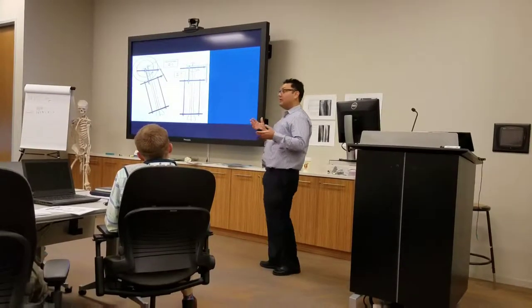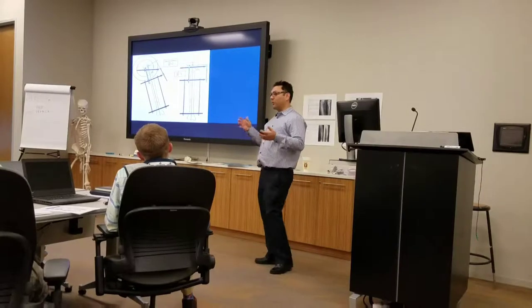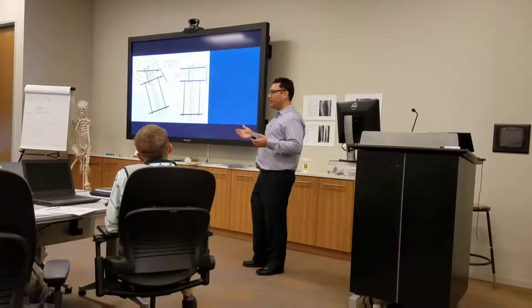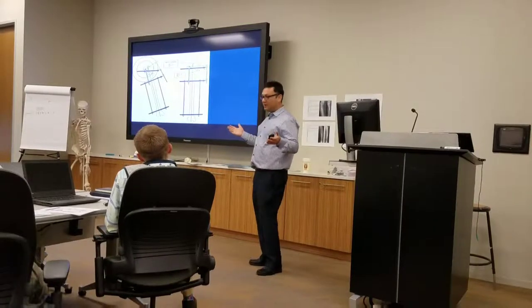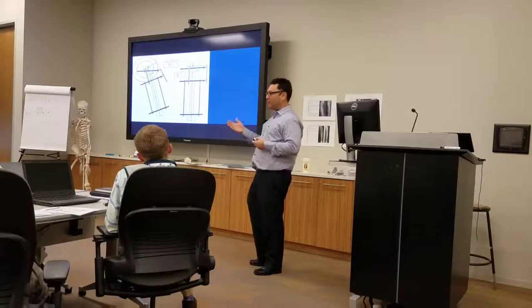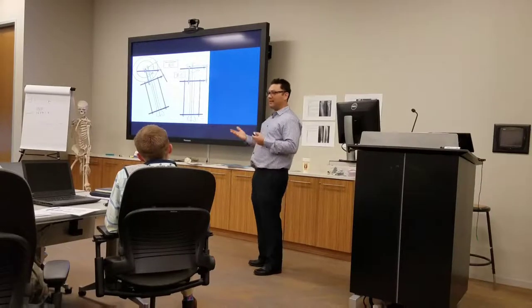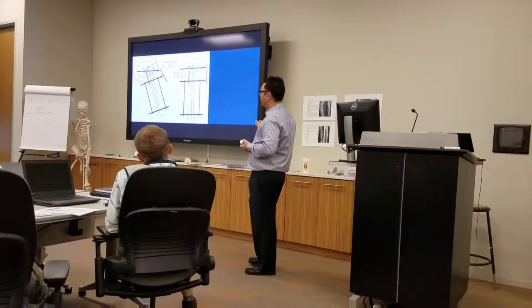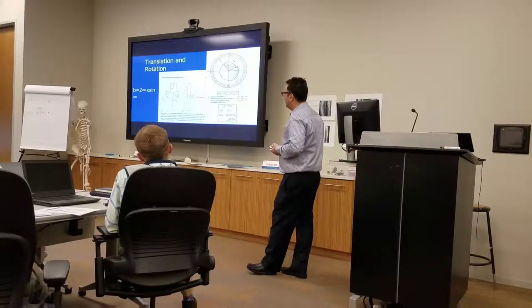Also, once again, the doctor's going to ask you, why should I want to do this? Why should I want to pick gradual correction? And the answer, if you're allowed to say this, is: what formulas are you using to know your rate of how much stretch you're going to have, how much correction, how fast you can go on your acute correction, with the nerve structures and everything around that area?